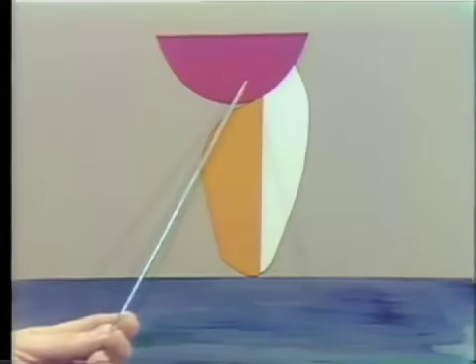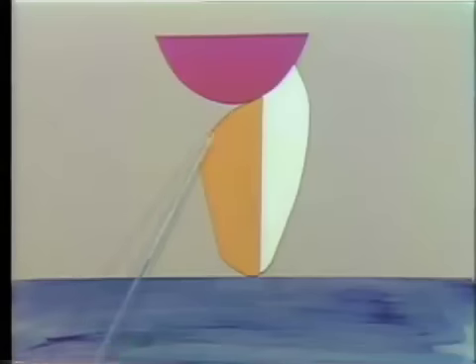This diagram shows a labial lingual section through a maxillary anterior pontic in which the Steele's flatback facing has been utilized. It shows the relationship between the porcelain here, the gold here, and the soft tissue of the alveolus here. This lingual contour, of course, has been developed by waxing onto the precious metal backing and then investing and casting that backing on to give the correct lingual contour.